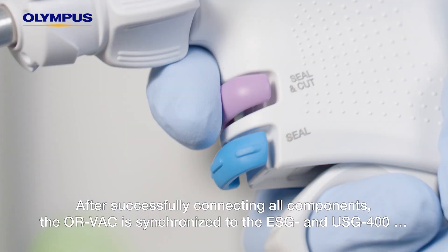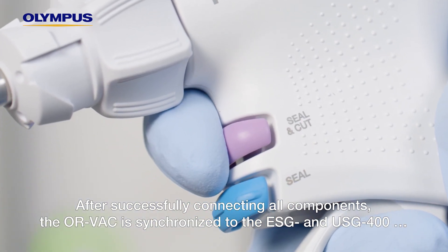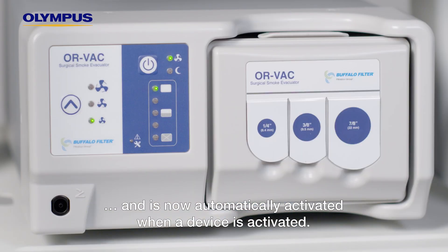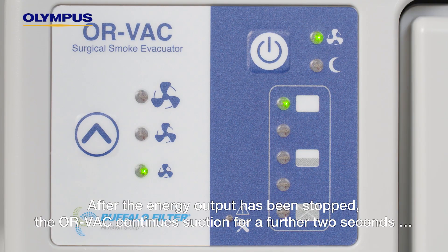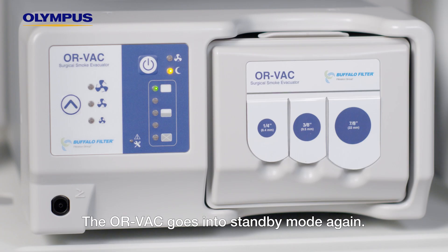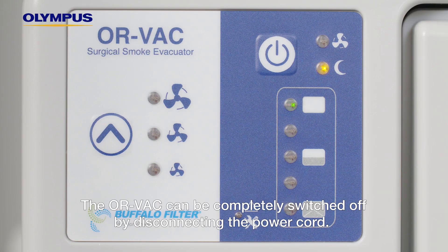After successfully connecting all components, the ORVAC is synchronized to the ESG and USG400 and is now automatically activated when a device is activated. After the energy output has been stopped, the ORVAC continues suction for a further two seconds in order to remove any remaining smoke, then goes into standby mode again. The ORVAC can be completely switched off by disconnecting the power cord.